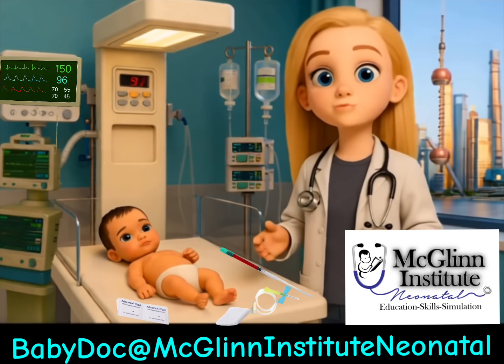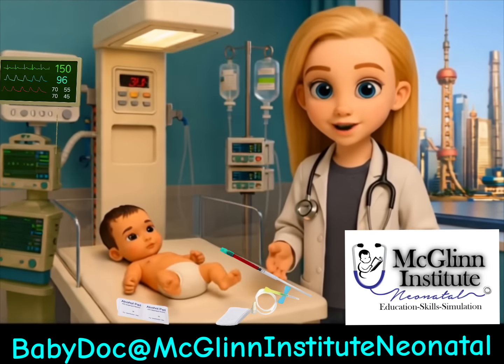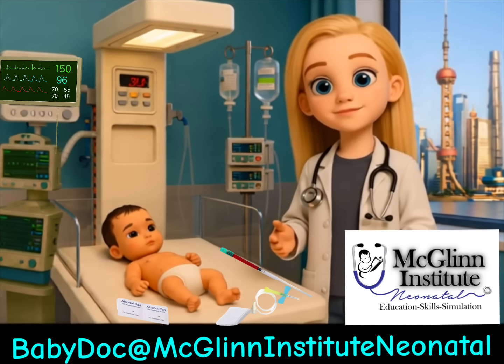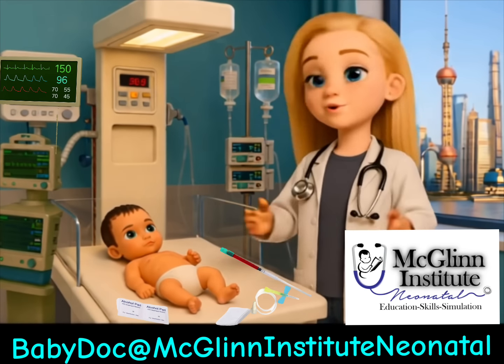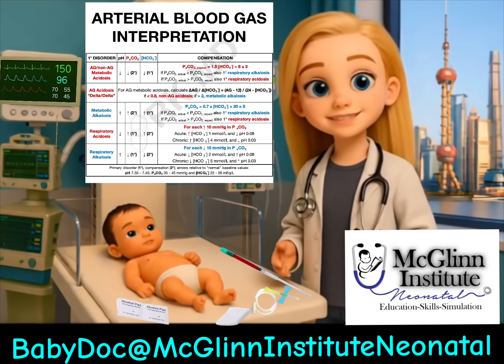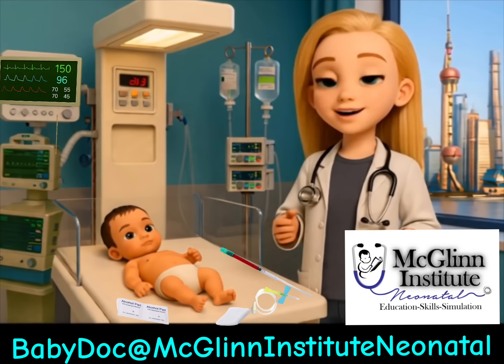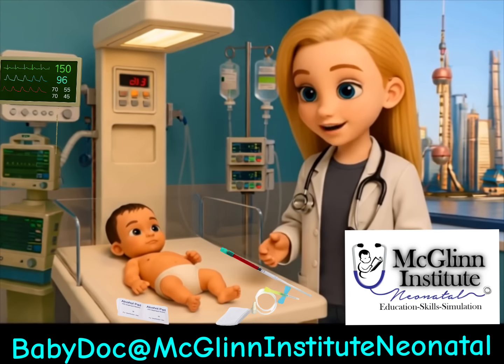The fourth step is to determine the level of compensation. Uncompensated: the pH is abnormal, and only one component, respiratory or metabolic, is out of range. Partially compensated: the pH is still abnormal, but both respiratory and metabolic components are outside the normal range in an attempt to correct the imbalance. Fully compensated: the pH is within the normal range, but both components are abnormal, showing that the body has successfully compensated for the underlying issue.